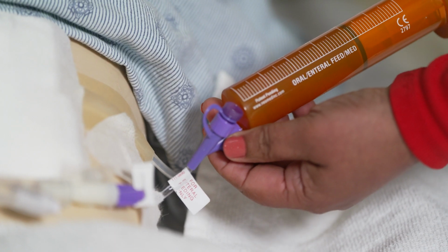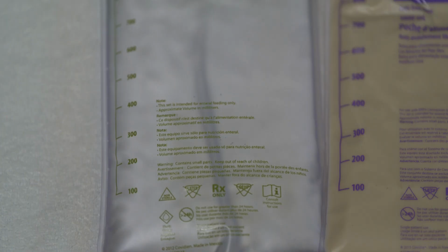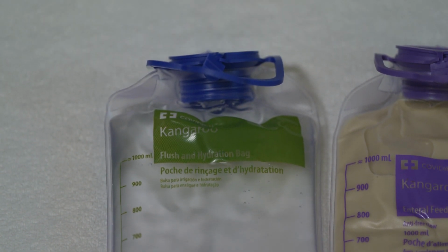After giving all the medicines, flush the J-tube with 30 milliliters of water. You may fill the flush bag with water according to the instructions you receive. Water can remain in the bag for 24 hours.